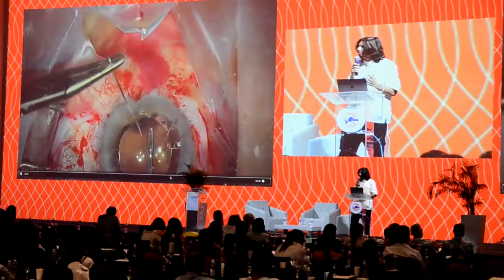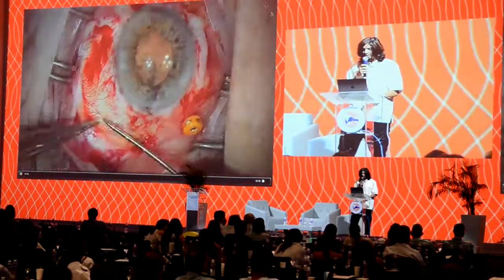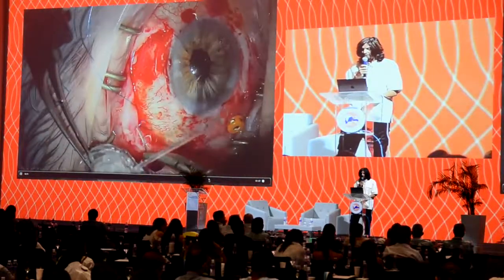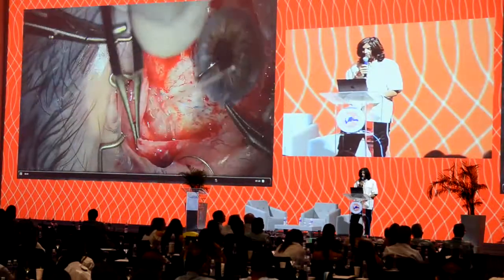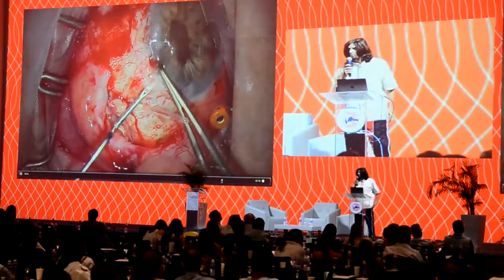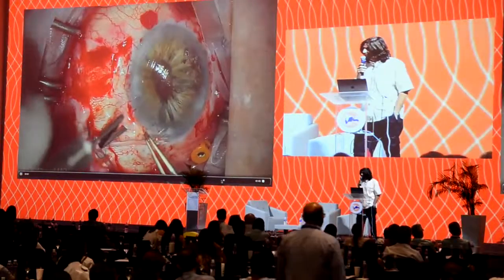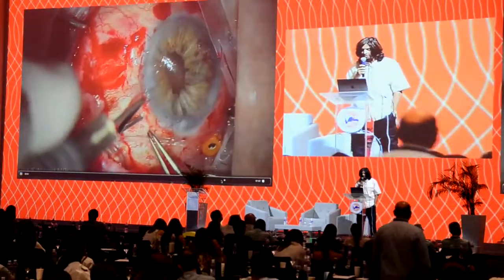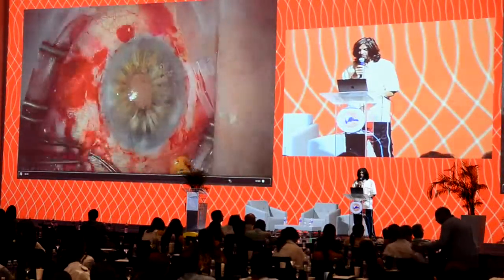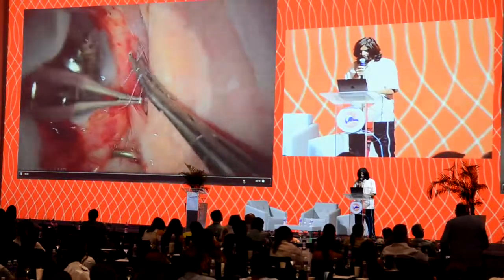We have to do the atonic pupil repair. So let's do that. I've already shown you the rest. I'll just fast forward that. Purse string around, tie the suture down. And then finally, we'll place our Ahmed valve here, suturing it down. We'll use a technique that Mauricio Tarati came and visited with us, and we have now adopted this technique. Felix Hill and Mauricio and the gang at APEC use a scleral tunnel, placing it through there, and then closing up, and that's basically the end of our case.